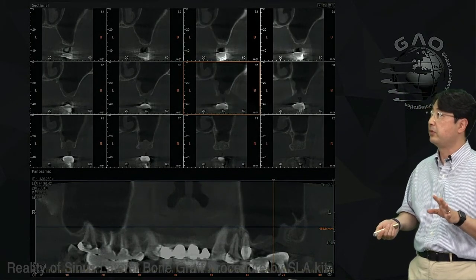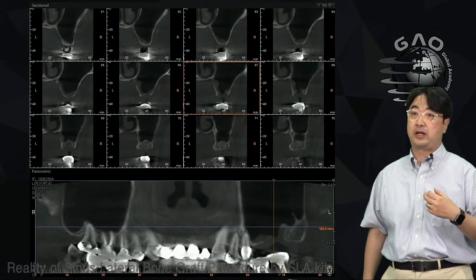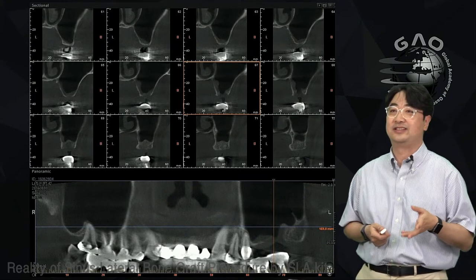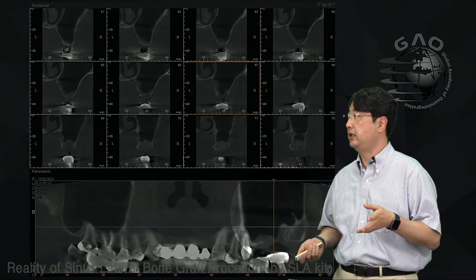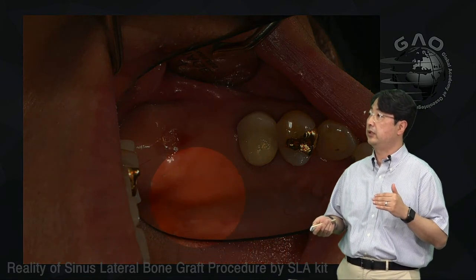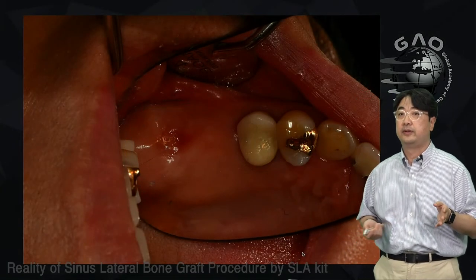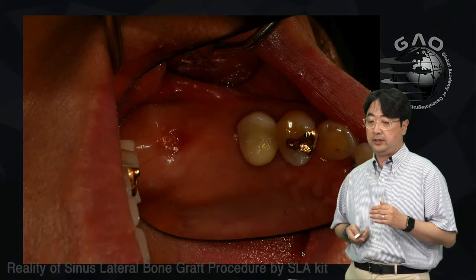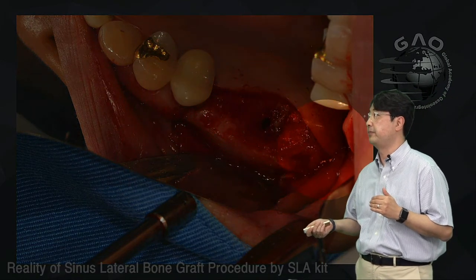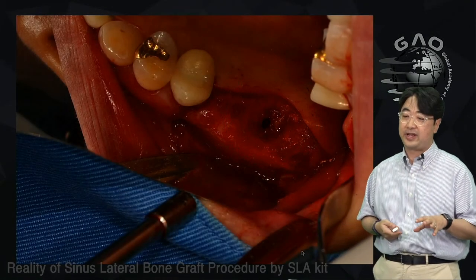But still, the problem is here you can see the opening, right? So an opening of the crestal part. This membrane thickening, I think, is from an odontogenic origin, right? So here you can see the opening in the crestal area. This is the clinical picture. As you see, the redness on the crestal area, maybe about the number 27 area, right? When I opened the flap, I intentionally extended my incision to the palatal side. So I found the opening, and also I found the perforation of the membrane.